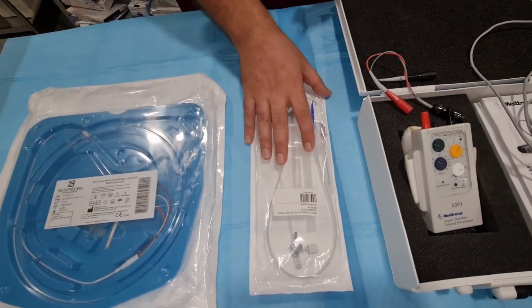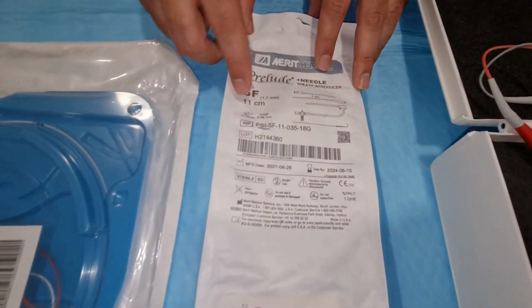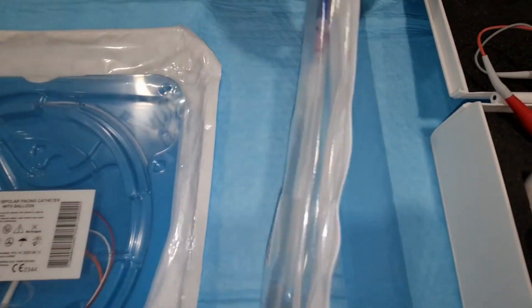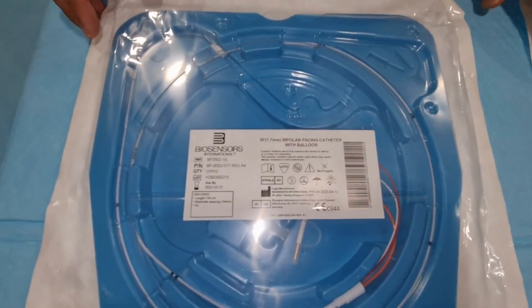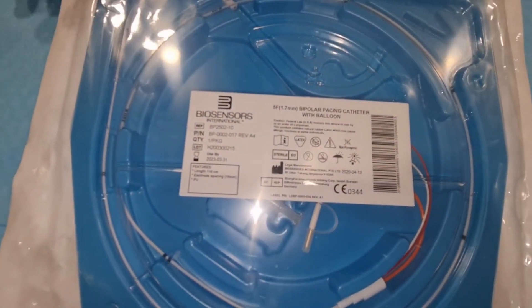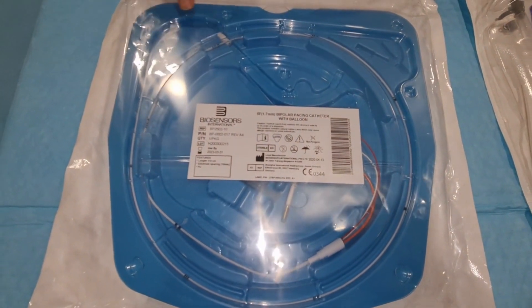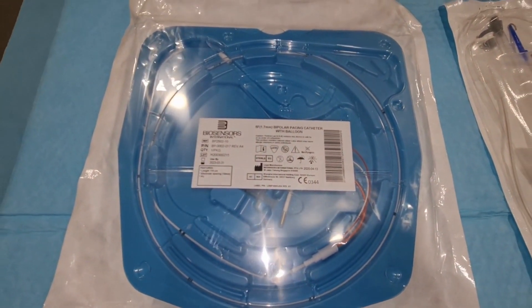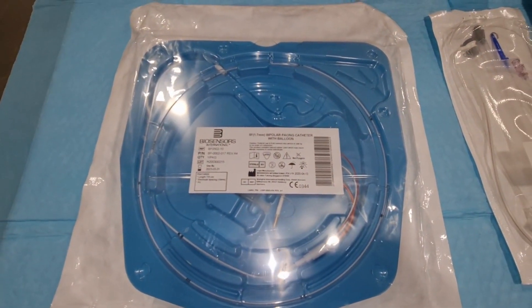Next we require, if it is 5 French, we are going to have a 5 French sheath, femoral sheath for the venous access. Then, this is the TPM lead with the balloon tip. Now I will show you how to prepare this generator for use.